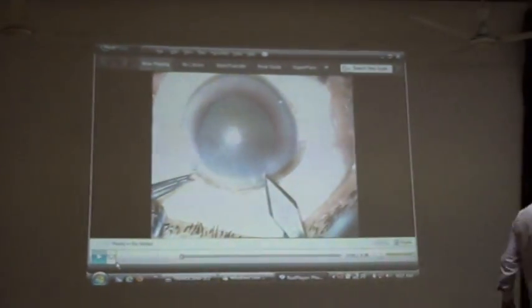It will take hardly 30 minutes total, but before understanding the main presentation video, I want to share whatever surgery we are doing there and what is extra in that video that was presented. So this is only a simple phacoemulsification and IOL implant procedure that we regularly practice here. And just let me introduce a few steps.